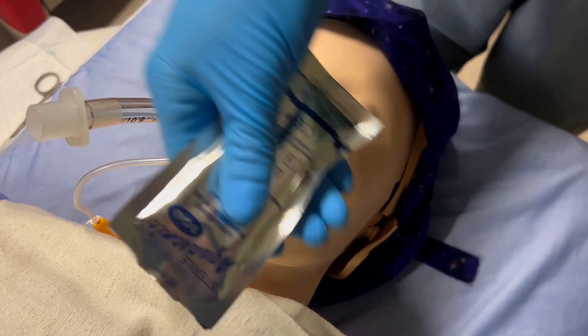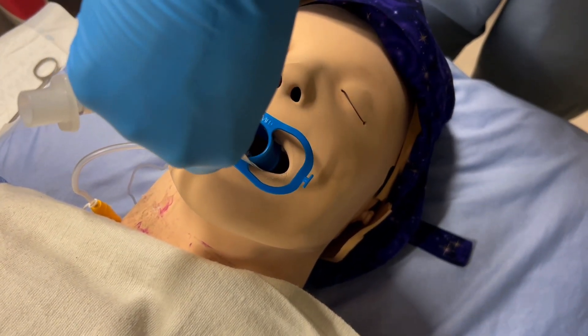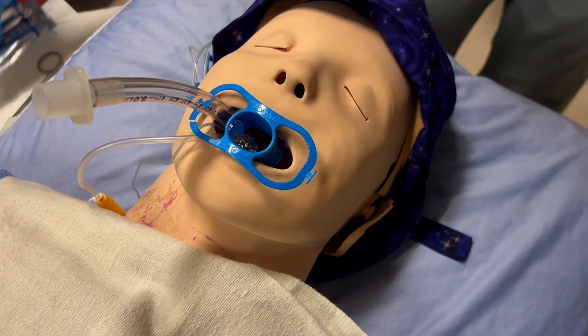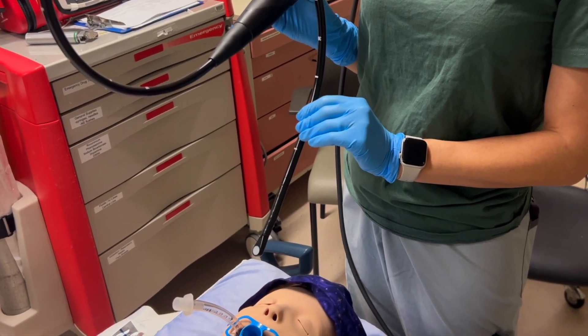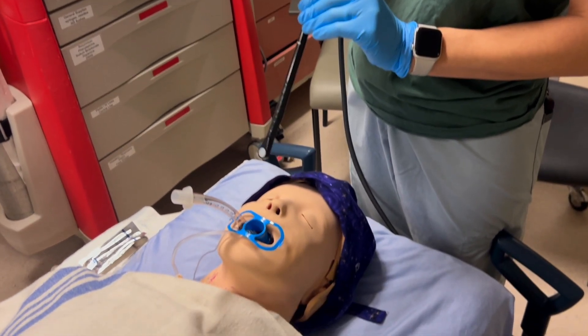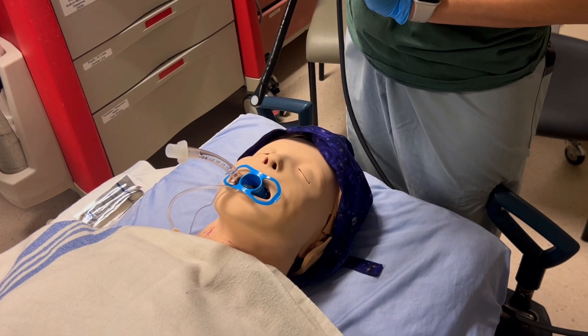Next, you must apply a liberal amount of lubrication into the bite block to allow the probe to pass easily. You can also apply lubrication directly onto the head of the probe. In ICU, intubating for transesophageal echo is typically done from the head of the bed. As the procedure is uncomfortable, please consider giving additional sedating agents. This may involve also changing the ventilator setting to a control mode.